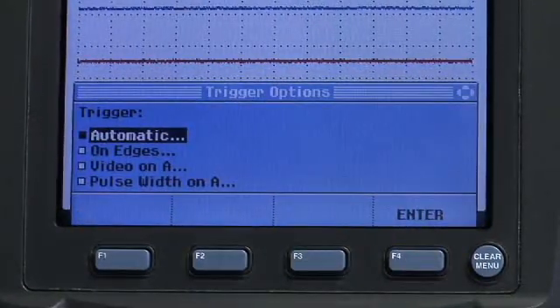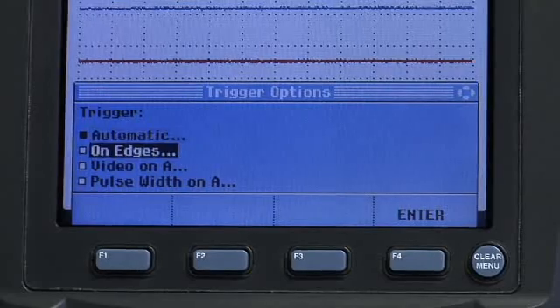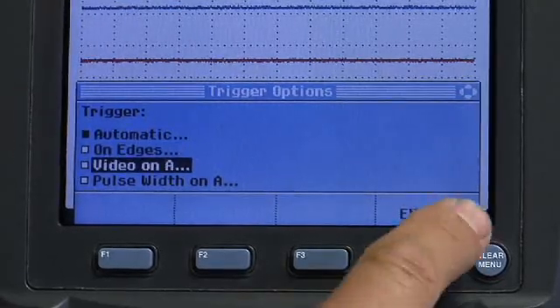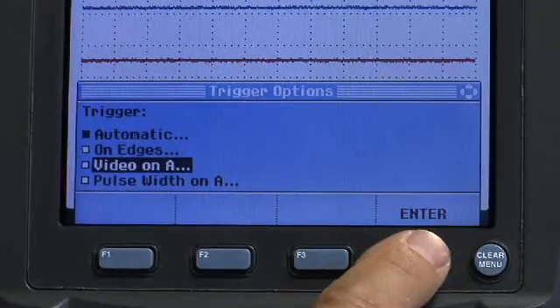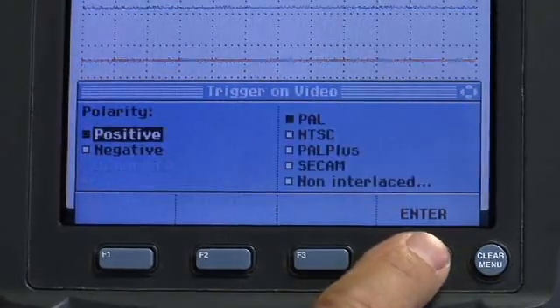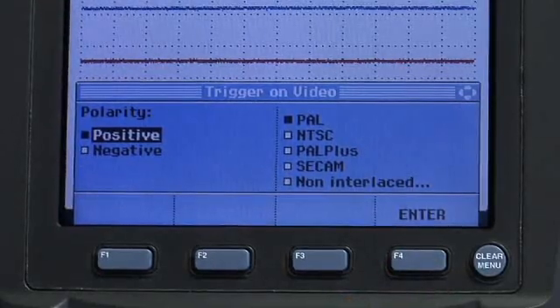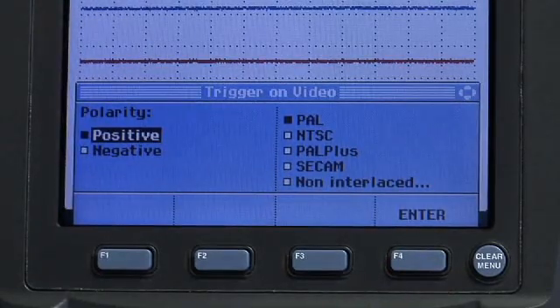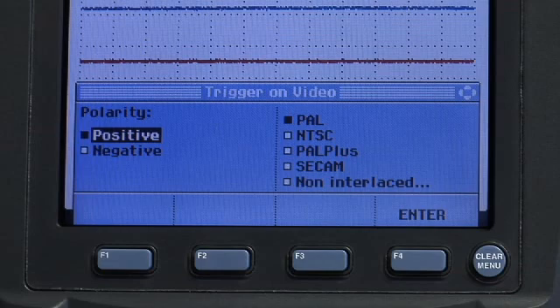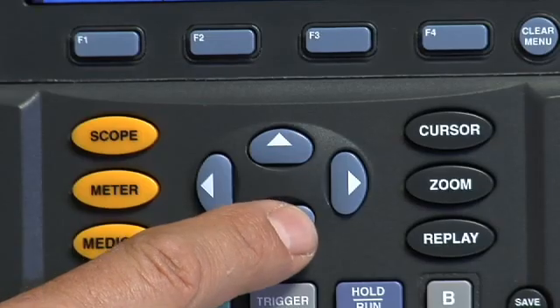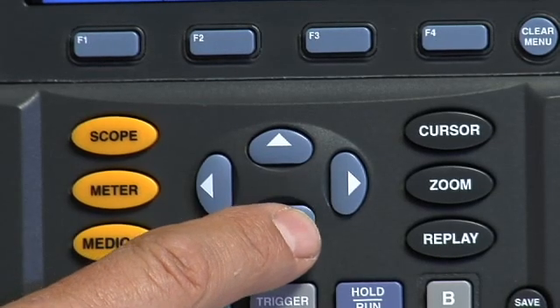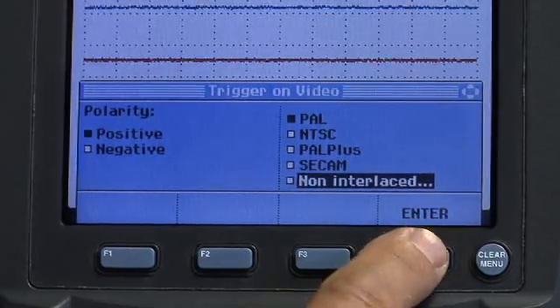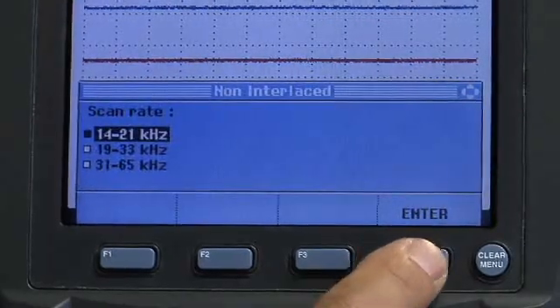Select video on A to open the trigger on video menu. On the trigger on video menu, select positive polarity for video signals with negative going sync pulses. Next, select non-interlaced to open the scan rate menu.